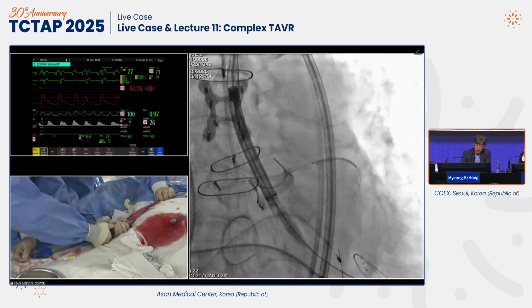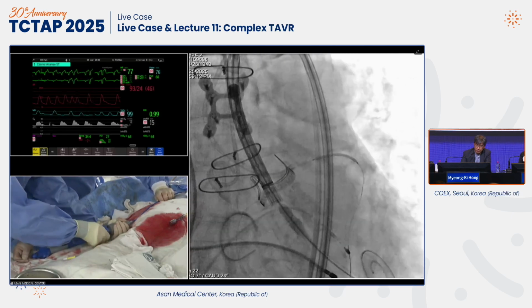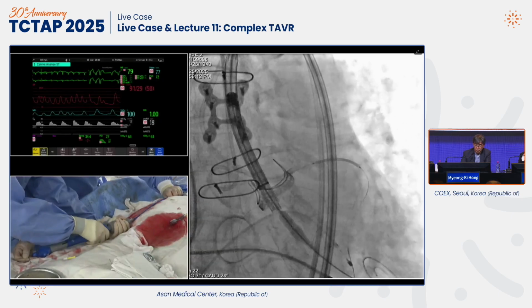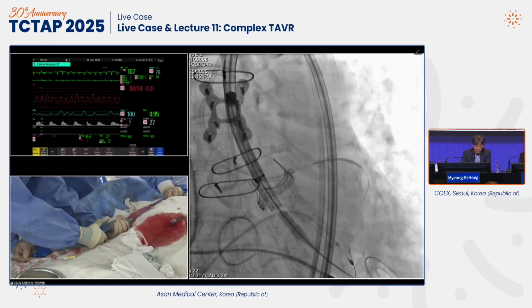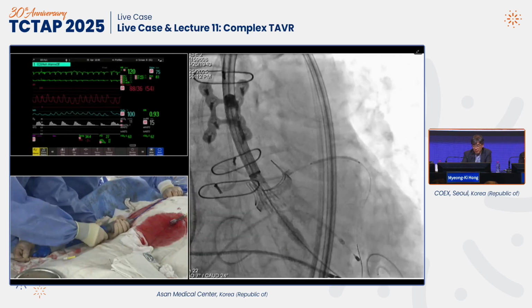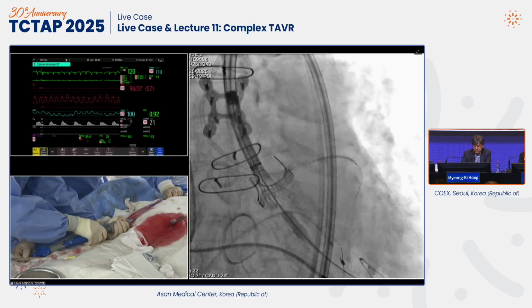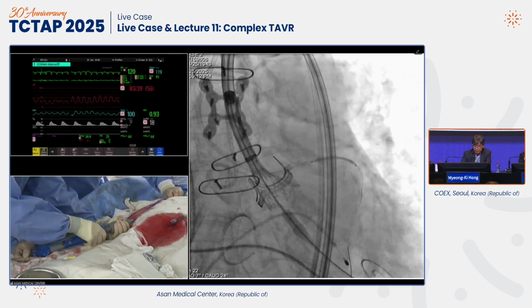They'll get it. Slowly. I'm confident. Release, a bit slowly. Release. Now try pacing at 120. Release. Okay, release. Pacing. More slowly. Release. When we release it, it's transmitted in the distal part. It takes time. I think it's much better. Wait a bit. It's definitely 120 millimeters? Two lower. Release. Much better than before. Okay, release. Good.